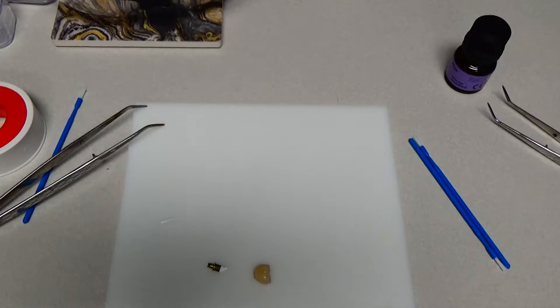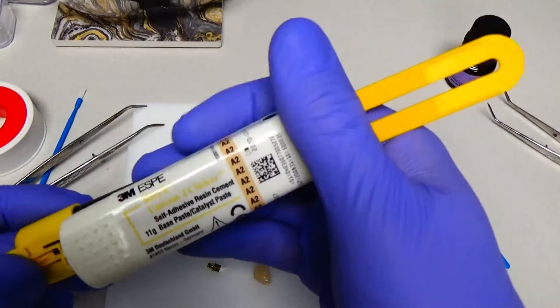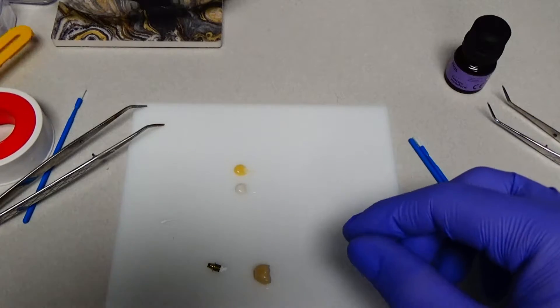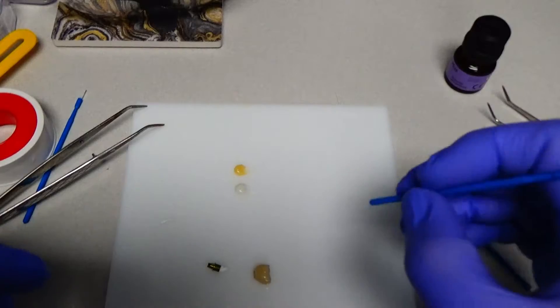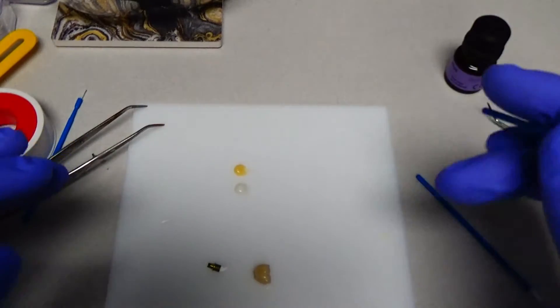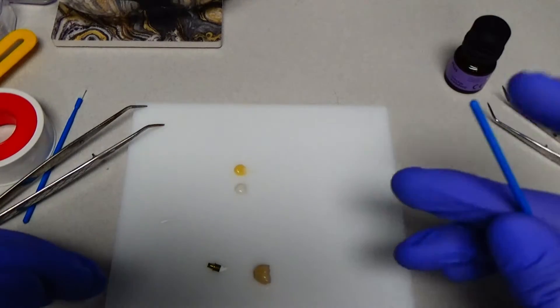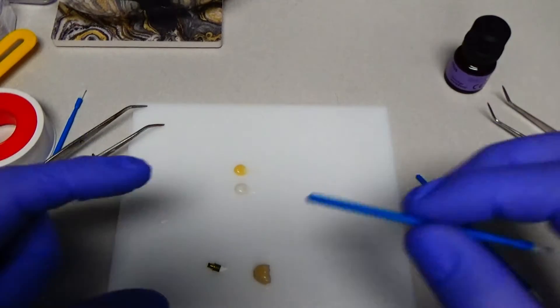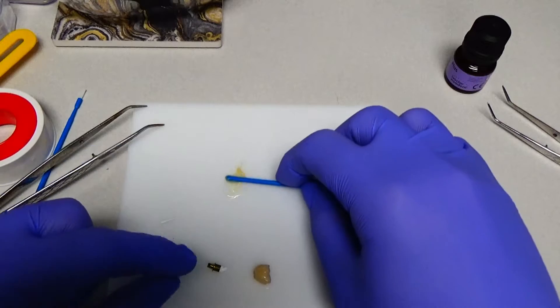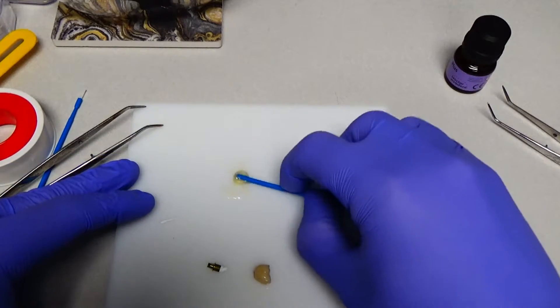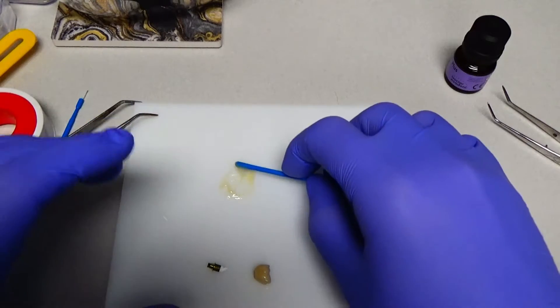So the Reliax Unisem 2, don't need too much, just enough to lute it to place. And the nice thing about these abutments as well is that they have an engaging feature that only engages in one location. So there's no ambiguity. Sometimes there's ambiguity which orientation should I put this titanium insert on with some other brands, but there's only one way to do it here. So you don't need to do it on the cast if you don't want to.